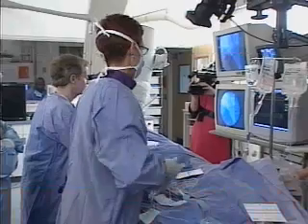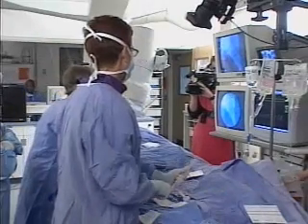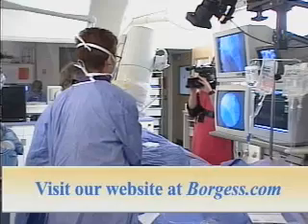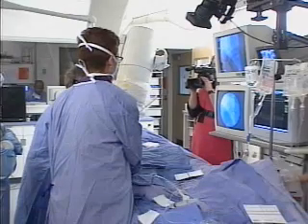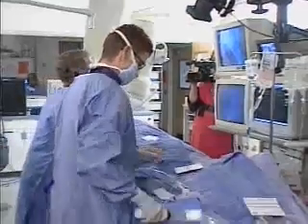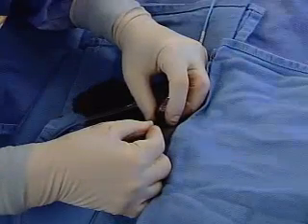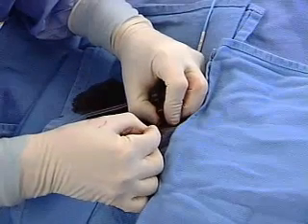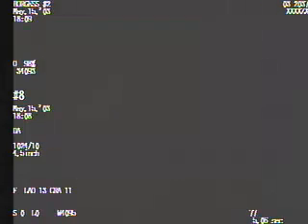I have a couple of other questions that have come in that I'm going to try to address while you're dilating the stent there, Bill. Someone emailed in a question: can you remove an old stent to put in a new one? That's actually a pretty good question. The answer is we can't really remove the old stent if it's reblocked. What we do, though, is we clean them out, stretch them open, and there's a trial going on and some early trials where we put the drug stent inside a blocked old stent. We call that a stent sandwich.